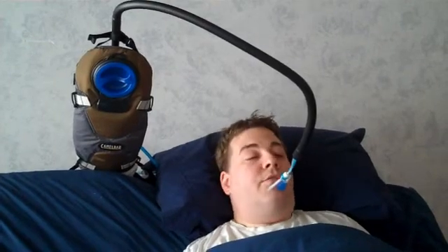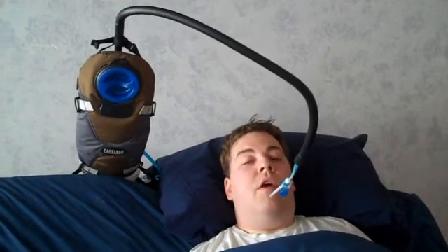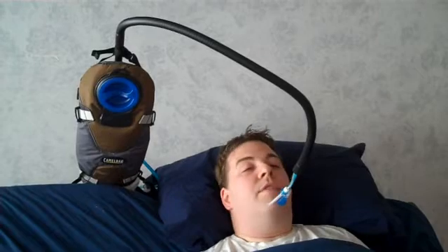Besides having independent access to water or other devices in your environment — like the phone or ECU — we can also fit the third arm bed mount with our quad mouse. So when you're lying in bed, you have independent access to a computer with just the slightest movement of your head.